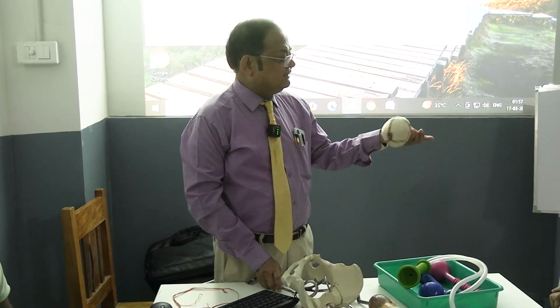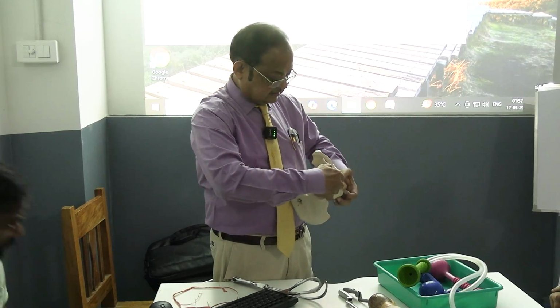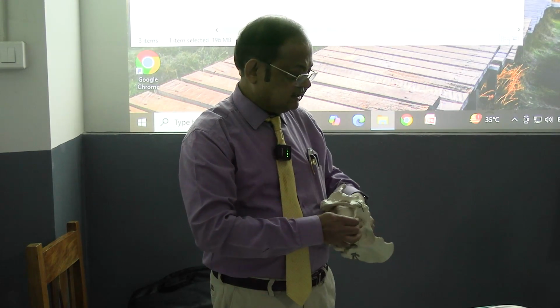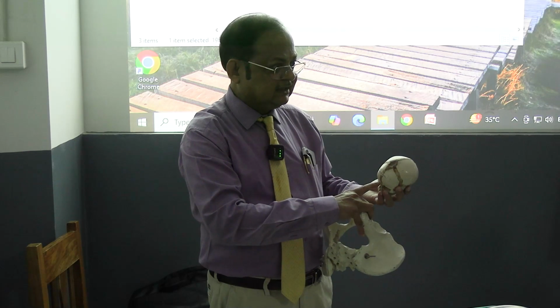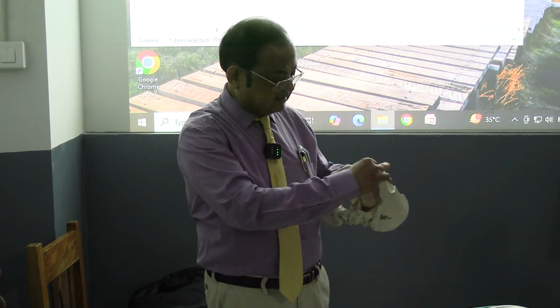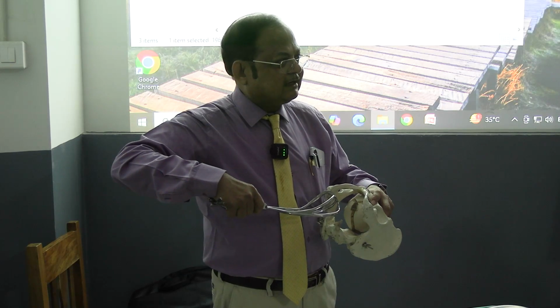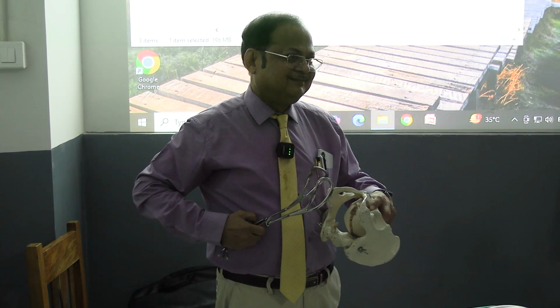If the sagittal suture is directly anteroposterior, with the posterior fontanelle and the anterior fontanelle, that is, the rotation is complete, you apply, and the cephalic curvature and the pelvic curvature correspond with each other, so there is no problem.